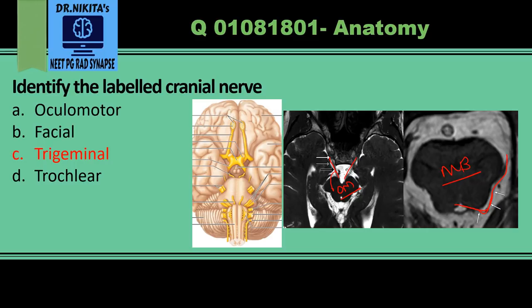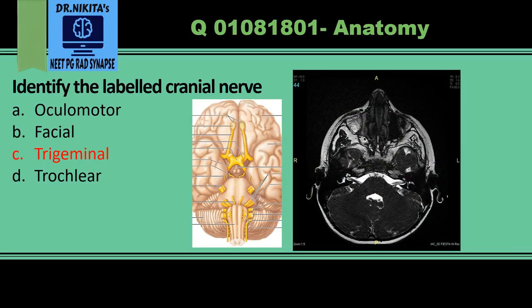The trochlear nerve crosses to the opposite side. Next is the facial nerve. The vestibulocochlear and facial nerve — the seventh-eighth nerve complex — arise at the pontomedullary junction in the cerebellopontine angle. Here we have the pons, the fourth ventricle, and the cerebellum. These nerves come and go into the internal auditory canal — that is the seventh-eighth nerve in the cerebellopontine angle.